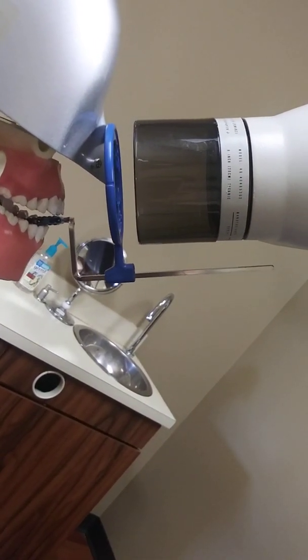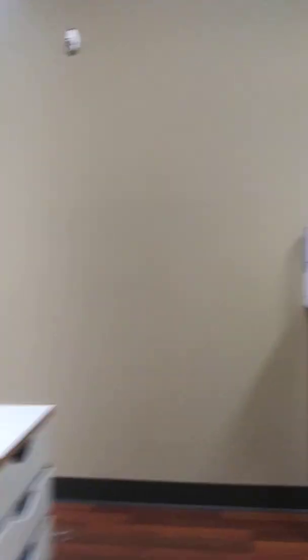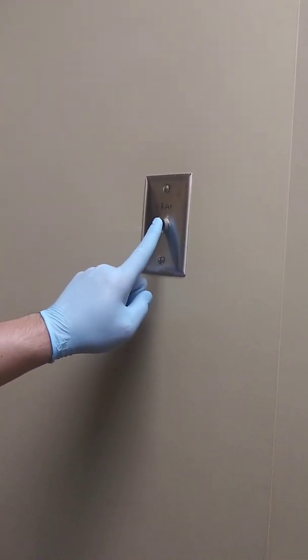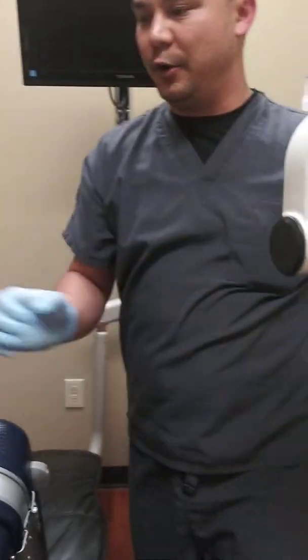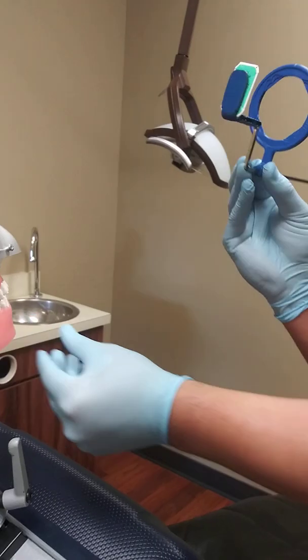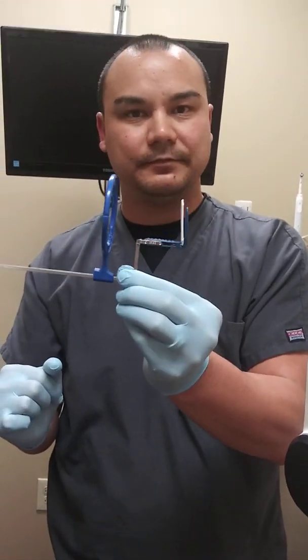So once positioned in the mouth, I would tell the patient to stay holding. Then I would walk right out of here. Right here is our exposure button. Of course, we'd normally have our PPE on, but I would press and hold the button. Once the beep stopped, I would come back in, move this out of the way, and ask the patient immediately to open up, where I would then remove the film holding device. So now we have an exposed film that's ready for processing.